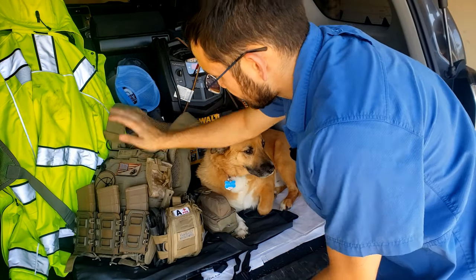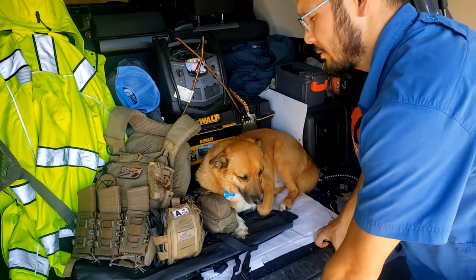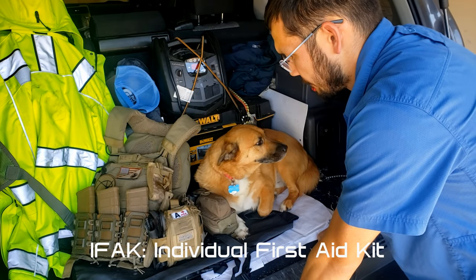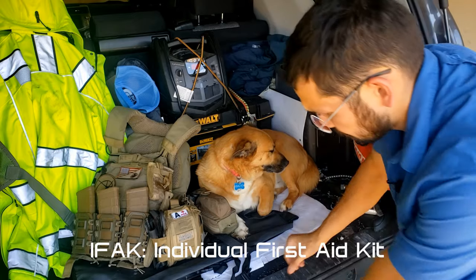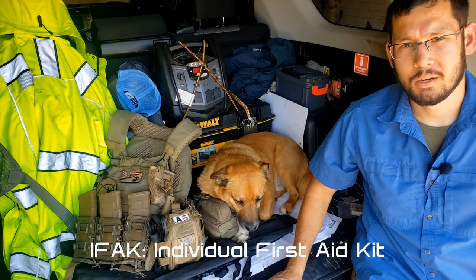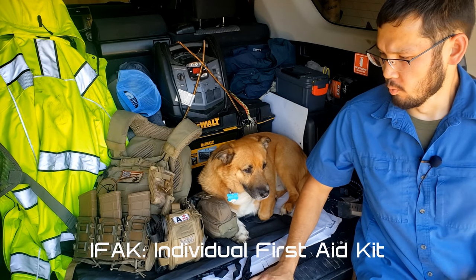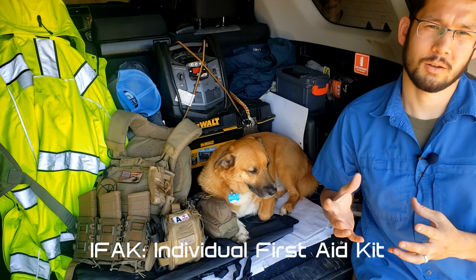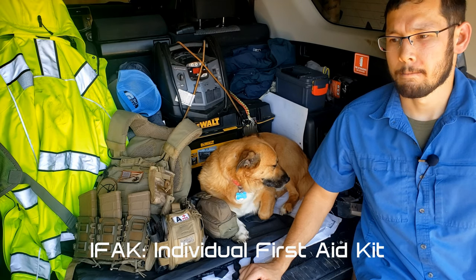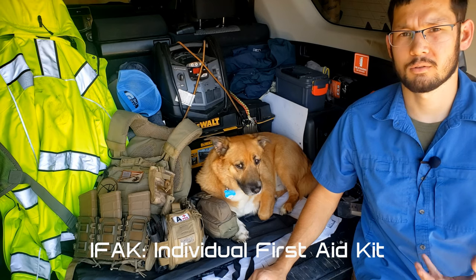I know some of you guys have asked about tactical systems and whatnot, so obviously we have them. Videos will come at some point. So I carry an IFAK on my kit, and let me talk real quick about IFAKs. They stand for individual first aid kit, but they're not really about first aid though. For the most part, the IFAK's goal is a dedicated kit designed for emergency trauma. Generally speaking, gunshot wounds and whatnot, but not just gunshot wounds. It could be lacerations and stuff like that, but we're talking emergency trauma.